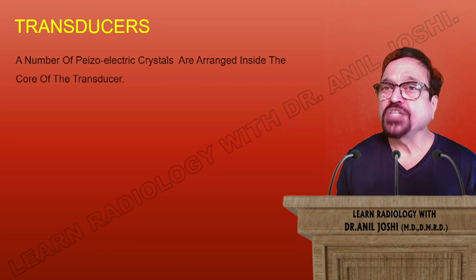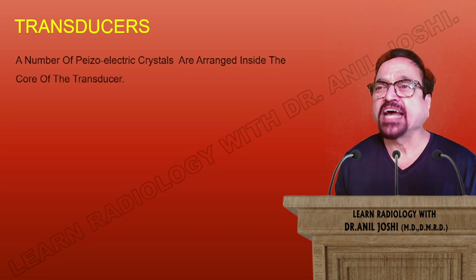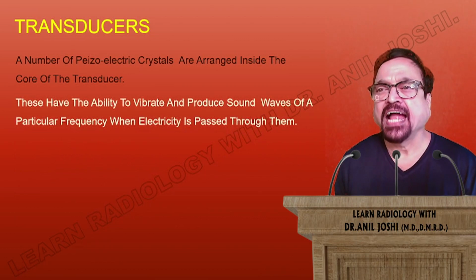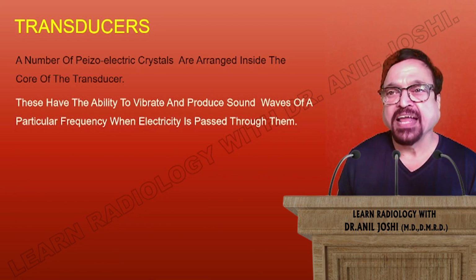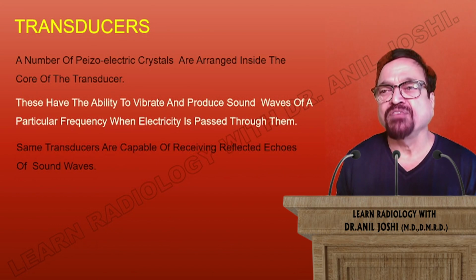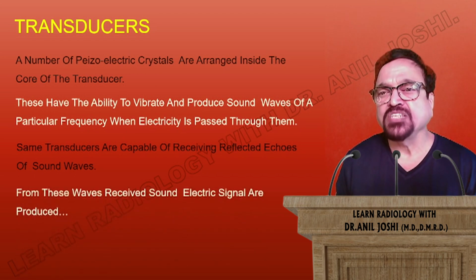The transducer consists of a number of piezoelectric crystals which are arranged inside the core of the transducer. These have the ability to vibrate and produce a sound wave of a particular frequency when electricity is passed to them. The same transducer is capable of receiving reflected echoes of the sound waves. From these waves received, electrical signals are produced.